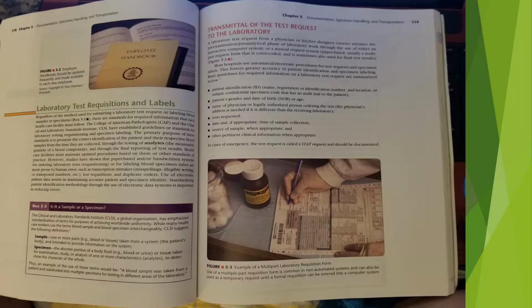Healthcare facilities must maintain updated procedures based on these or other standards of practice. However, studies have shown that paper-based and/or handwritten systems for ordering laboratory tests, requisitioning, or labeling blood specimen tubes are more prone to human error, such as transcription mistakes, misspellings, illegible writing, or transposed numbers, lost requisitions and duplicate orders. Use of electronic patient data assists in maintaining accurate patient and specimen identity.